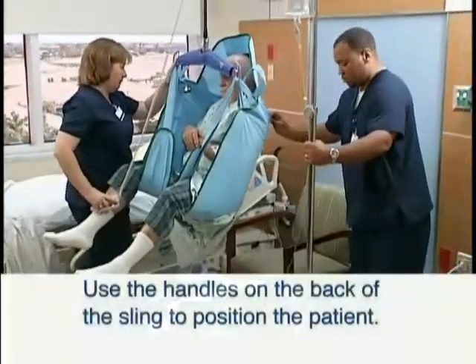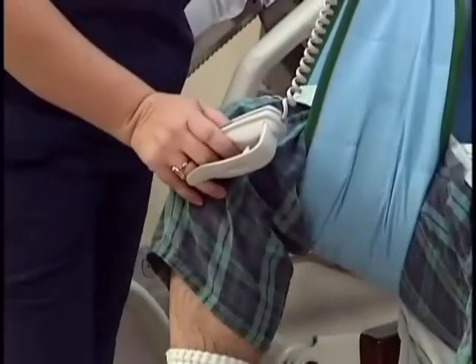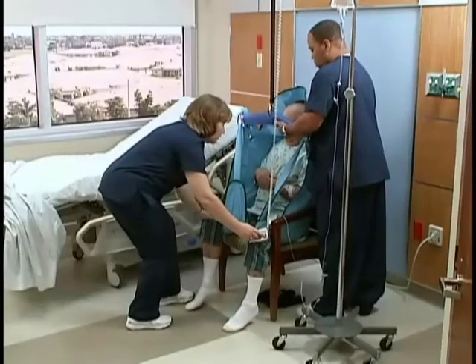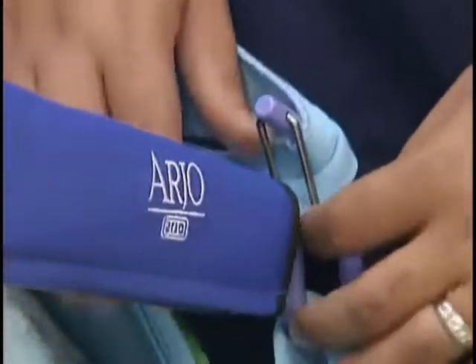Use the handles on the back of the sling to position the patient when transferring into a chair. Hold the hand control firmly as the sling lowers — the sling will tilt back to position the patient. Once the patient is properly seated and the straps are loose, remove the sling from the lift.